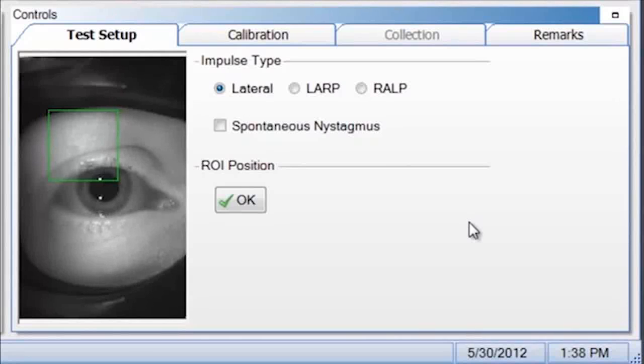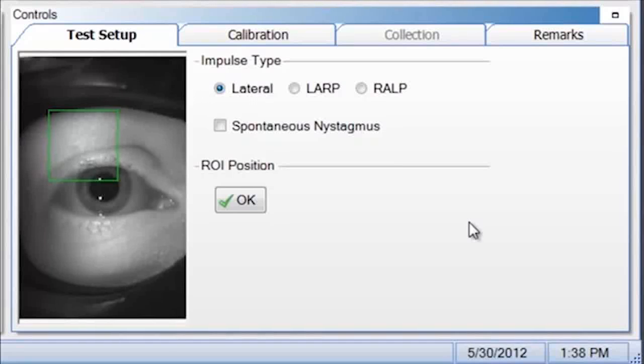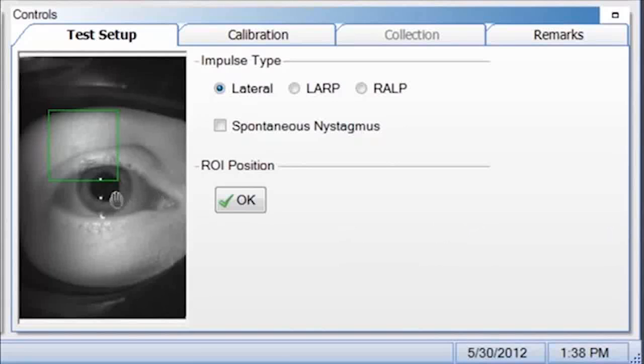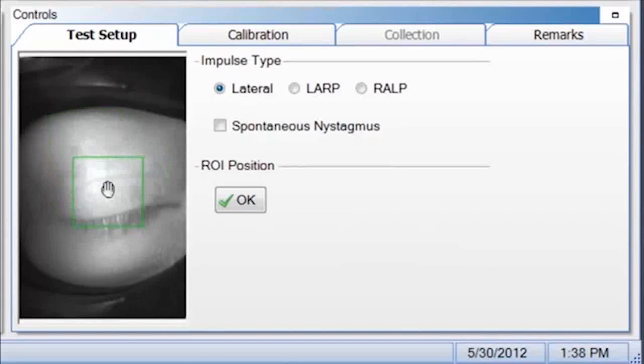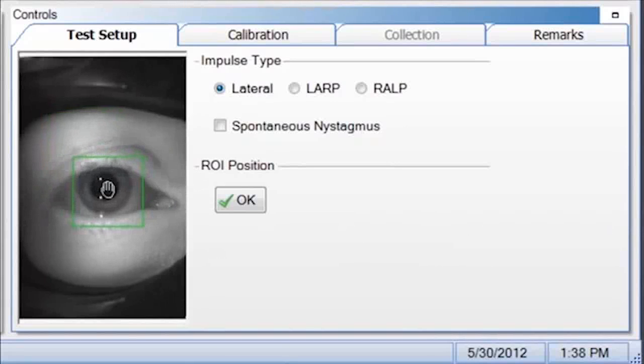You can do this either by left clicking and dragging the green square, or clicking on the pupil to center the pupil inside the green box. So let's click on the pupil, and now the green box is centered.